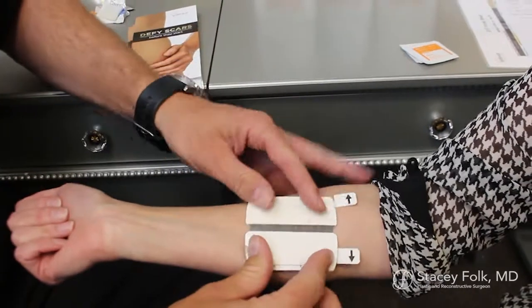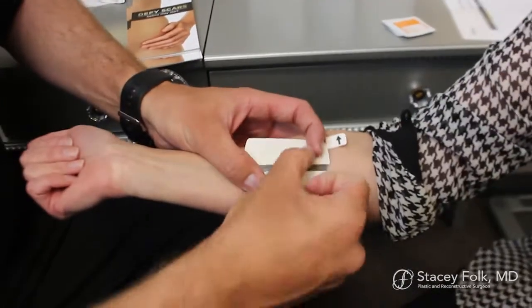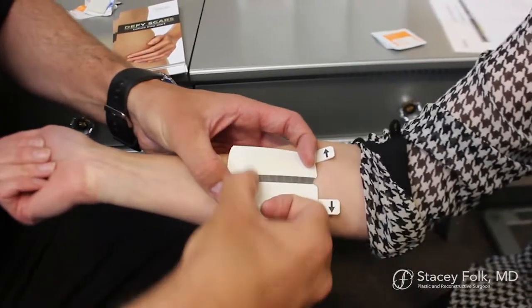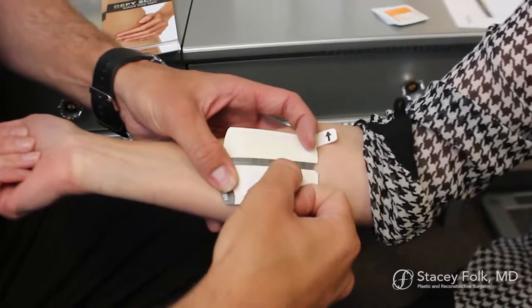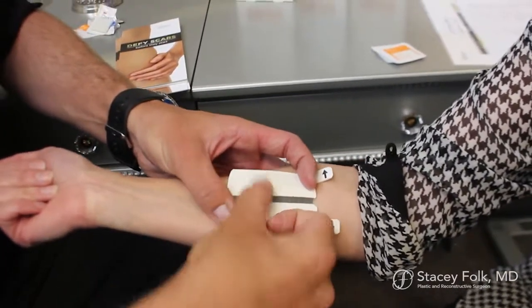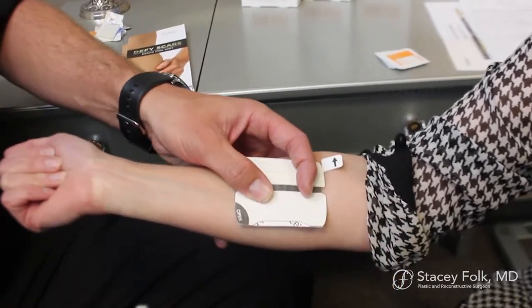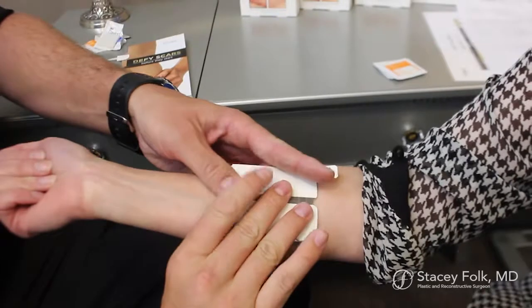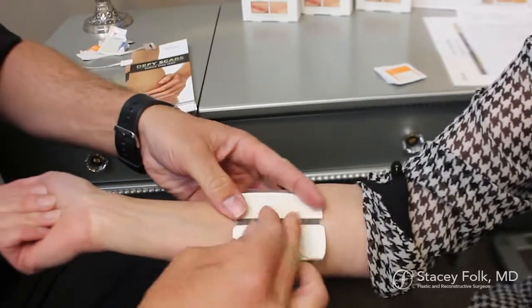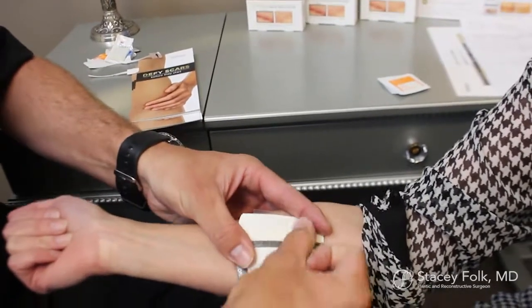He's pressing it down against my skin, and you really want to push and hold and apply pressure for about 30 seconds. That really gets things to stick down well, and the warmth actually helps it to adhere. Here comes the fancy part, these tabs on the side. You pull them away in the direction of the arrow. You know, I kind of feel like a flight attendant telling people there are two things. So then after you peel those off, you want to push down again.